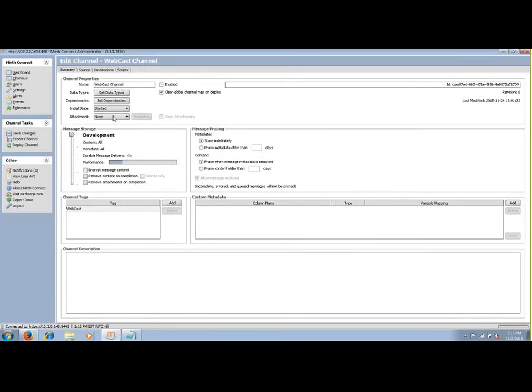Attachment is pretty interesting. This allows you to temporarily extract attachments from a message. Maybe you have a really large payload — Base64 encoded data, or an image embedded within a message. Some messages with multiple TIFF pages could be 15 megabytes. What this allows you to do is temporarily remove that attachment, which allows you to process the message a lot faster. You can store it or completely discard it.